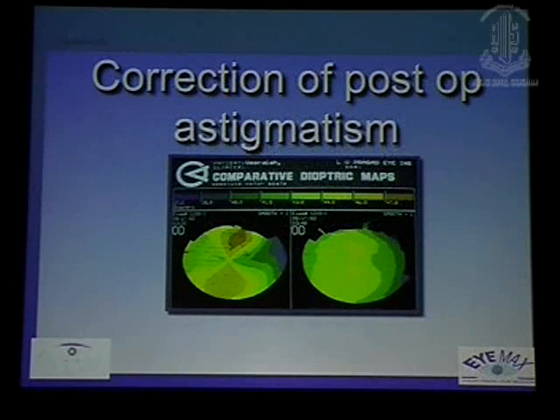So these are the major applications of topography, and I said that topography has become extremely important today for its role in refractive surgery, and all of us must know this procedure if we want to go into the field of refractive surgery.